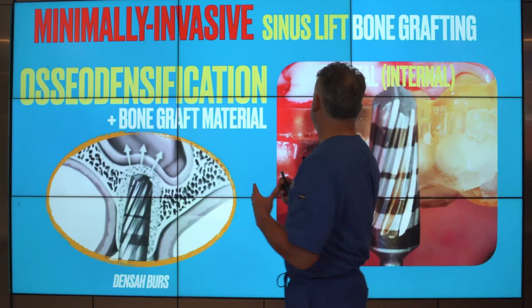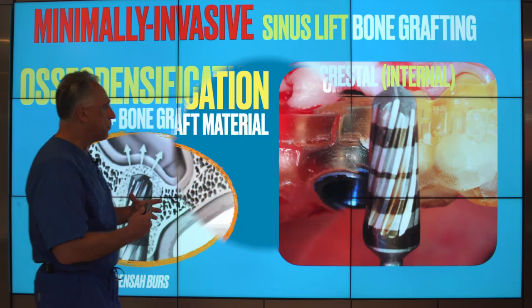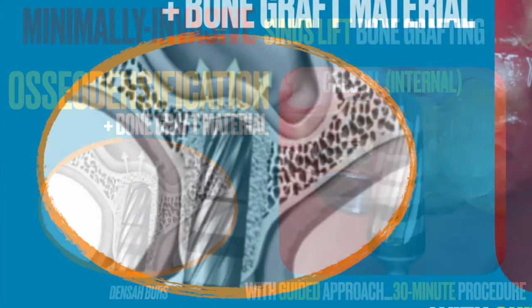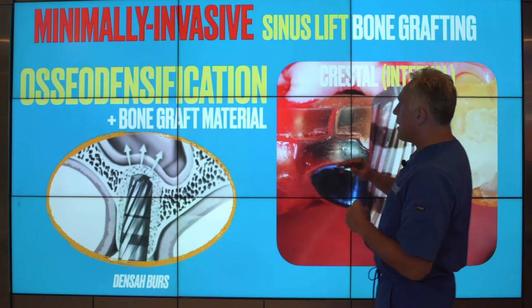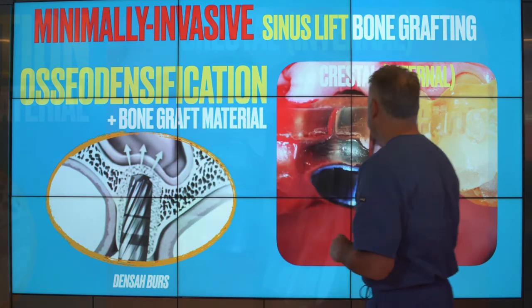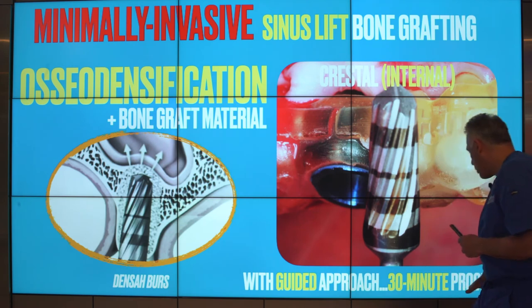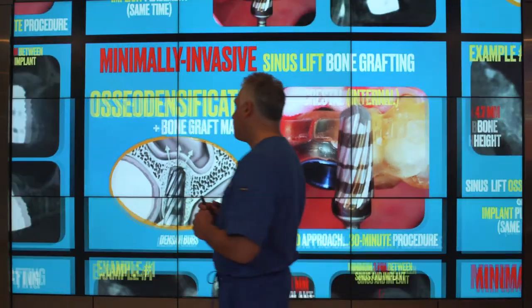So this approach for sinus lift bone grafting, known as osseodensification, essentially involves using specialized instrumentation, known as densifying burs, which allows us to compact and densify the bone at the time of the implant placement. This allows us to essentially make the bone denser and also raise the sinus floor by a reverse rotation of this specialized instrument. And when it's done effectively with a guided approach, it is usually no more than a 30-minute procedure to be able to place the implant and do the sinus lift procedure all at the same time.